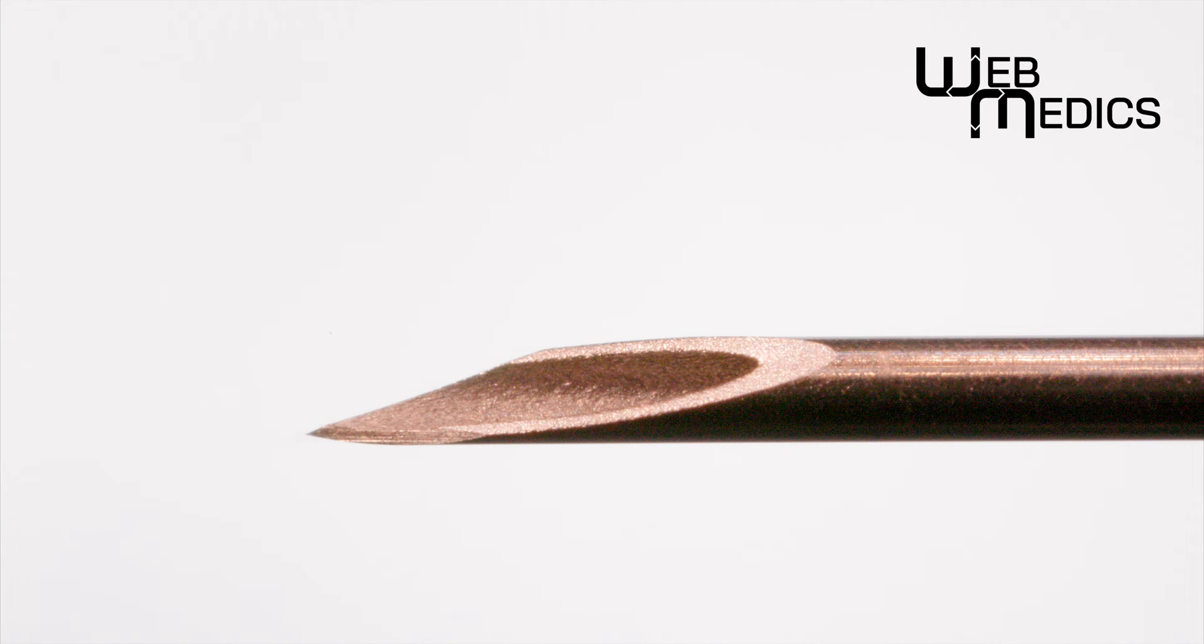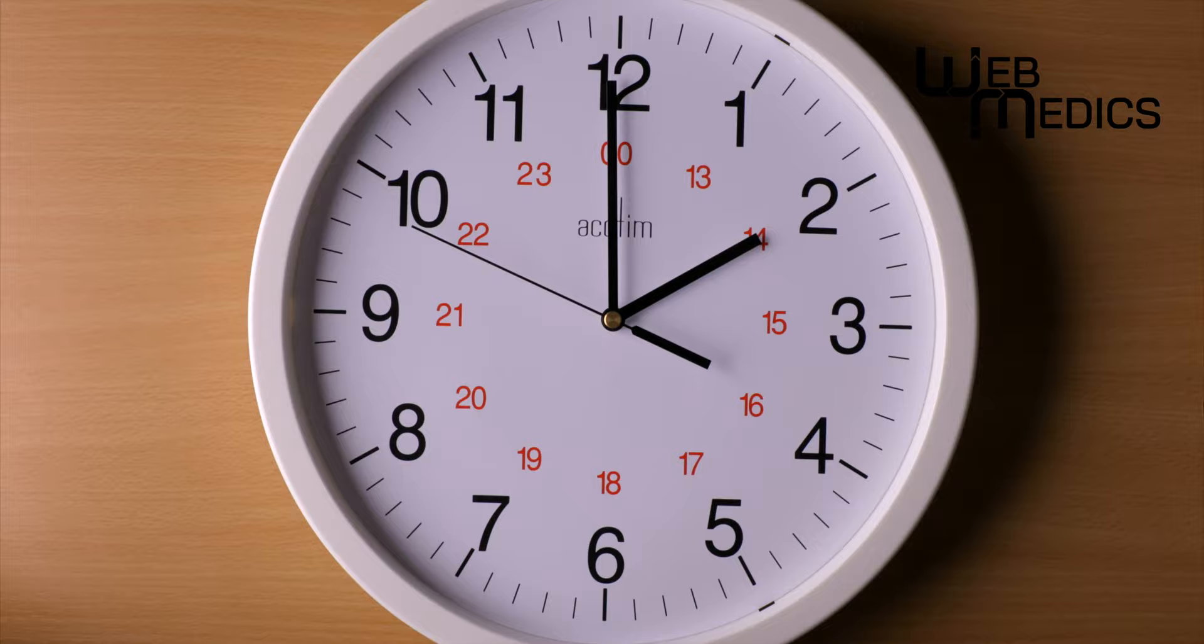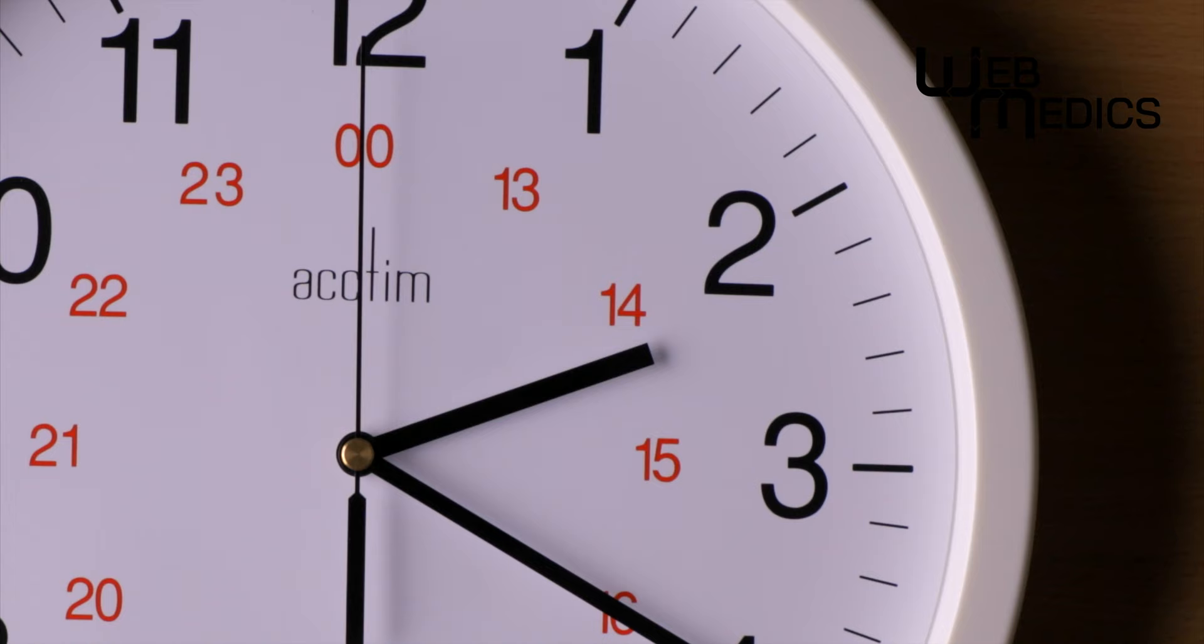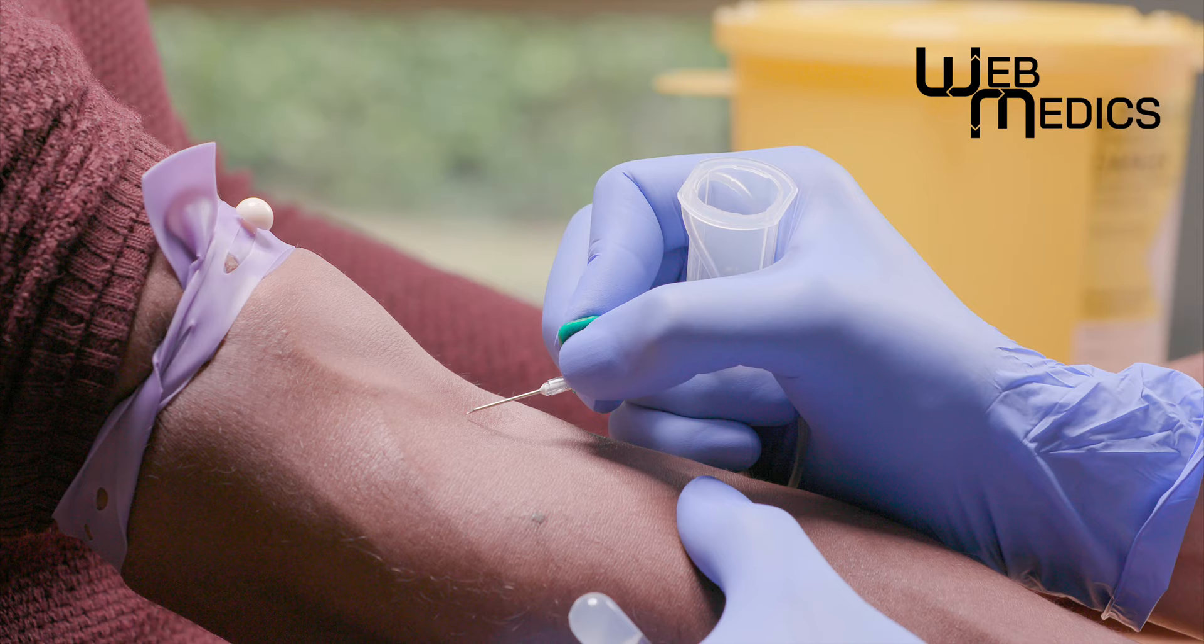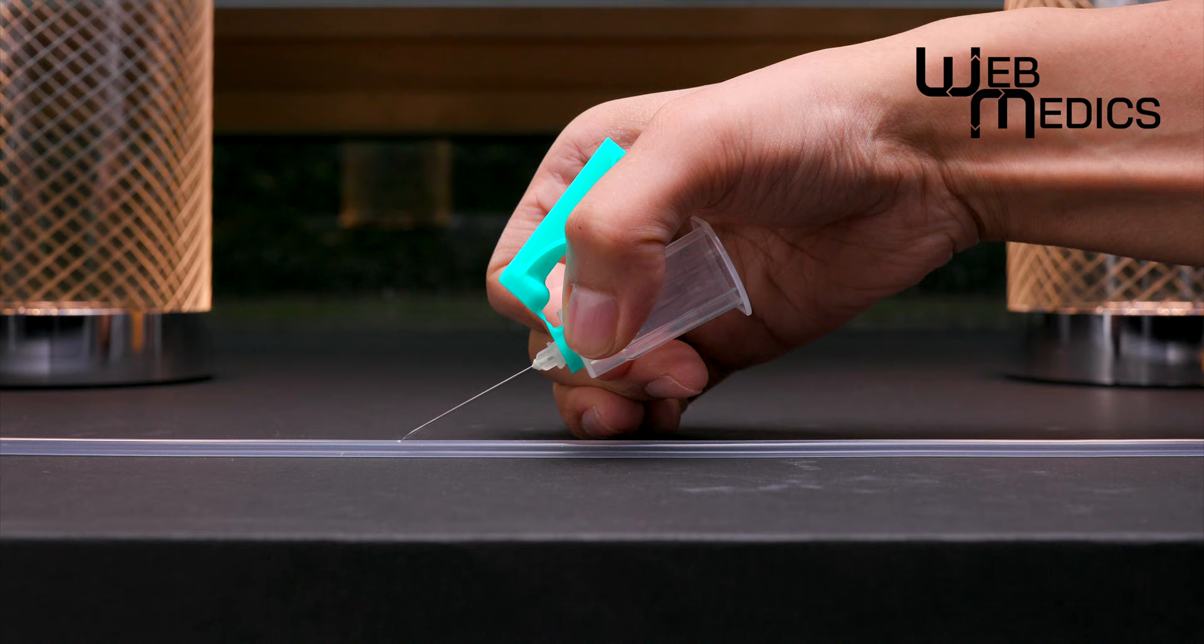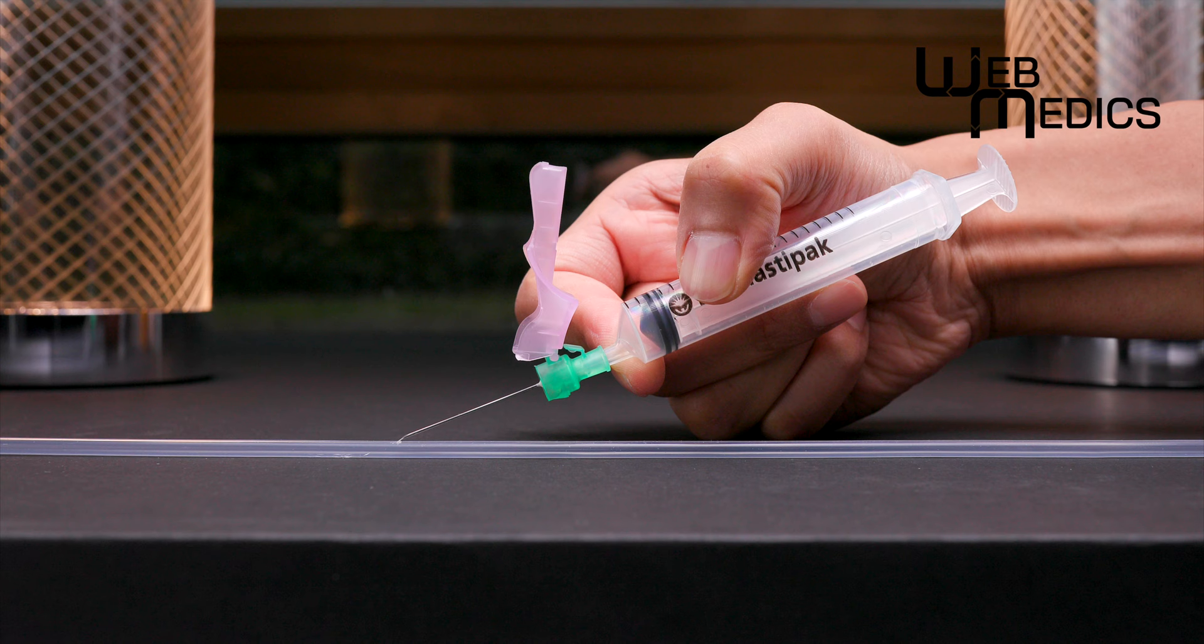Speaking of angle, where do we start? Here. If you look at the hour hand on any watch or clock, when the time is 2:20, the hour hand is at 20 degrees relative to the horizon. Shallow, low angles are better for soft, fragile, or small veins. Steeper, high angles are better for hard, calcified, or larger veins. The median angle of Roger Hoek's range is 20 degrees, which is roughly half the angle of our pen relative to a writing surface.